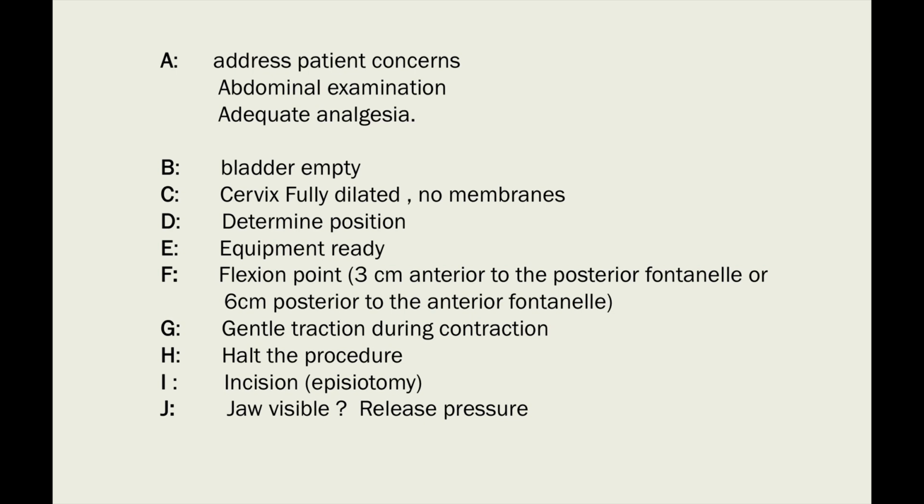Okay, the letter I stands for incision, which is our episiotomy. So once the head is proceeding to the perineum and crowning is happening, we need to consider episiotomy. Actually, we don't do episiotomy as a routine, but it's sometimes needed in cases of Kiwi delivery, just to give room for the head to come, and also to direct, if we are going to develop a perineal tear, the tear away from the back passage muscle.